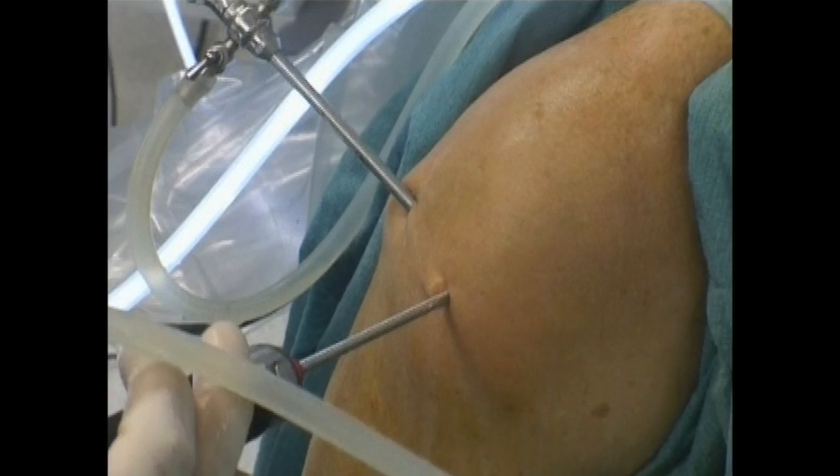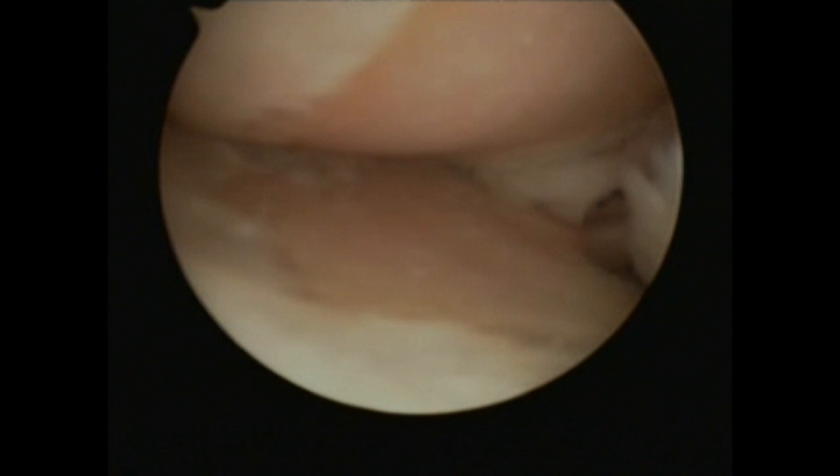The surgical technique encompasses an initial standard knee arthroscopy. Two standard portals, anteromedial and anterolateral, are made, and the state of the articular cartilage and the menisci is evaluated.